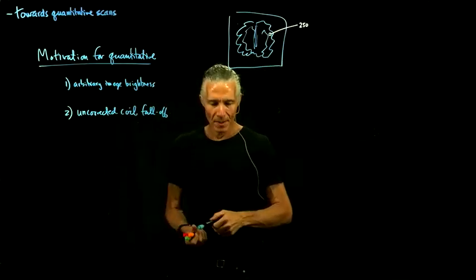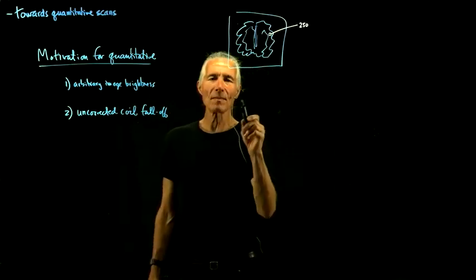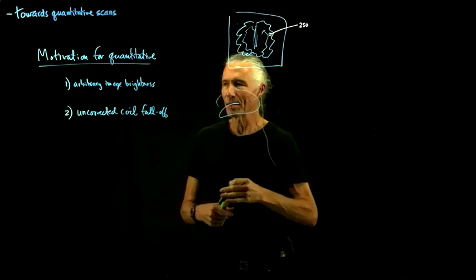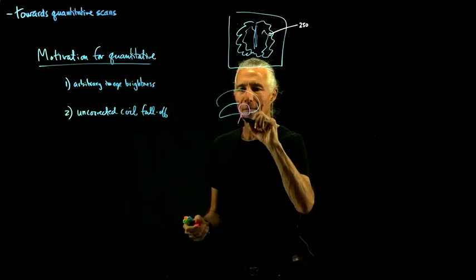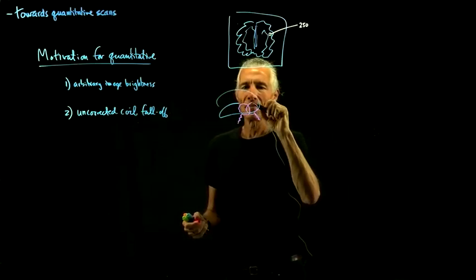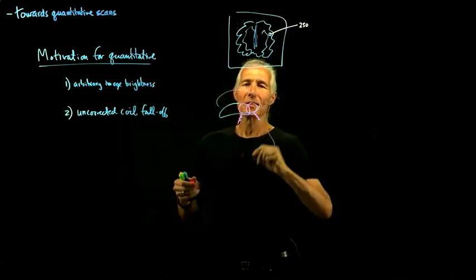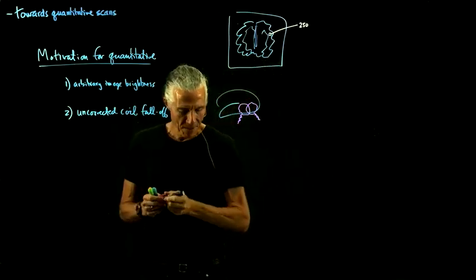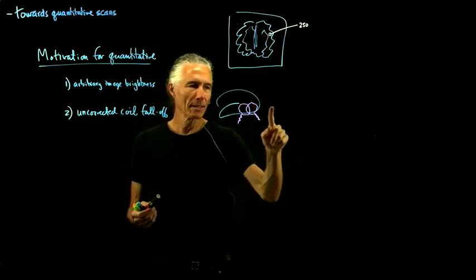But now we have setups with these small coils, and they have several properties. One property that I mentioned before is that they actually have better signal to noise.